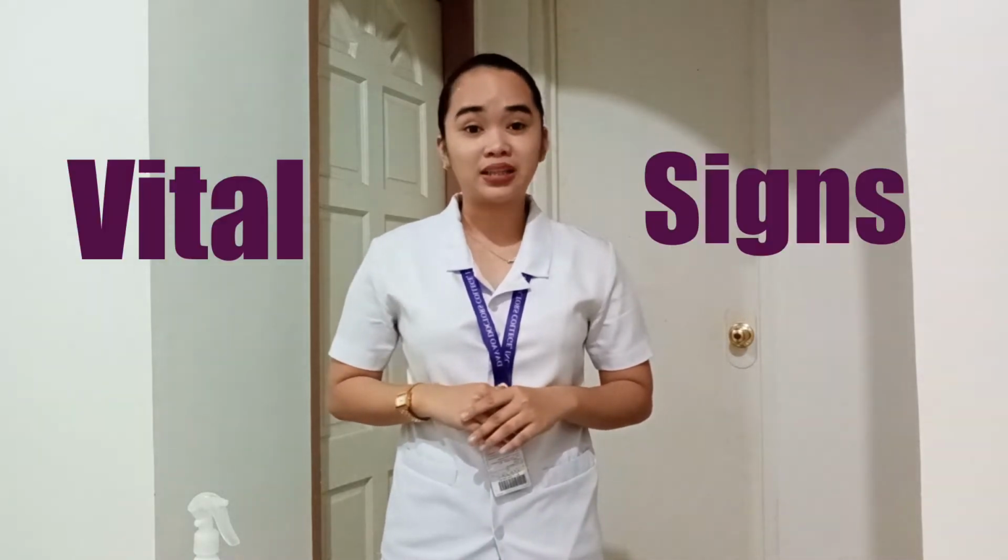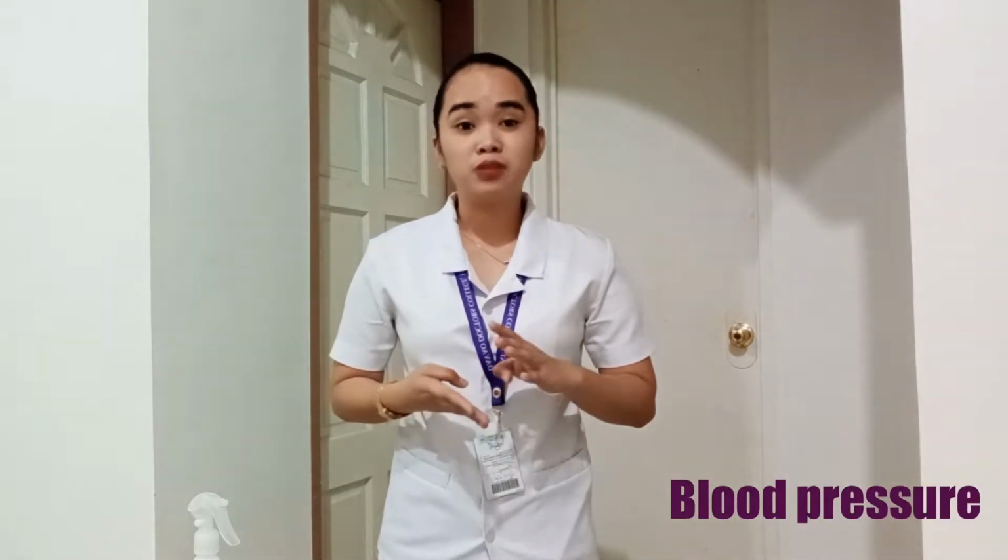Good day everyone, I am 𝐬𝐨𝐿𝐢𝐚 from BSN111B, and today I'll be showing you my return demonstration in obtaining vital signs. Vital signs are the measurement of the body's most basic functions such as body temperature, pulse rate, respiratory rate, and blood pressure. It is important as it is useful in detecting and monitoring medical problems.